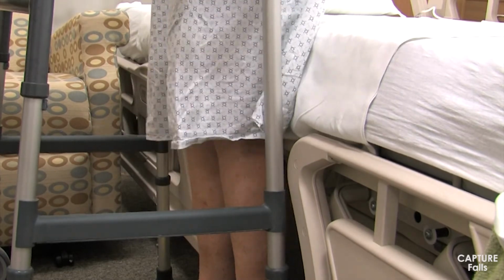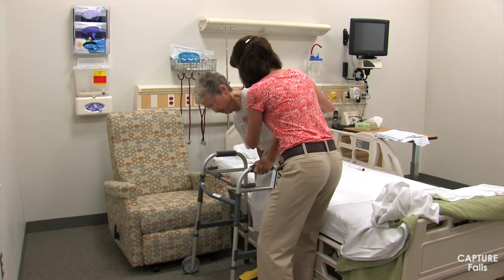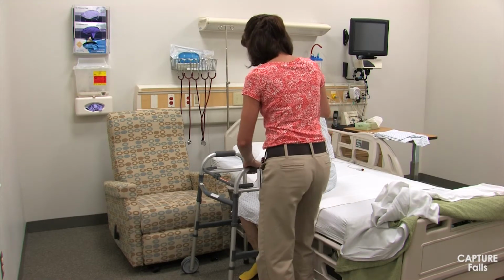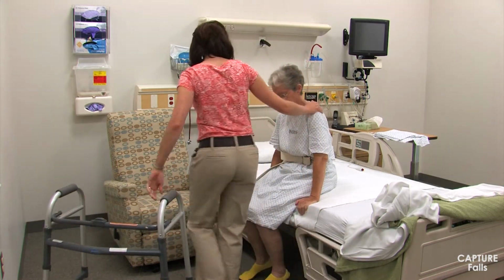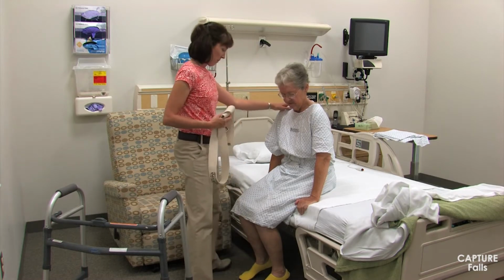When the patient feels the back of both her legs touching the bed, have her reach back with one or both hands for the edge of the bed as she slowly lowers to the sitting position. As you help the patient lower to the sitting position, you can squat down with your legs as the patient descends to help keep your back in a good position. Once the patient is sitting, move the walker out of the way. If needed, help the patient scoot back on the bed and remove the gait belt from her waist prior to assisting her into supine.